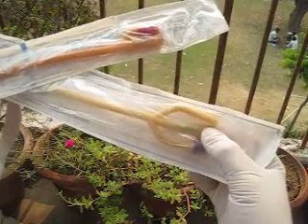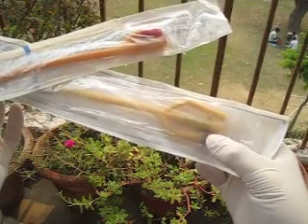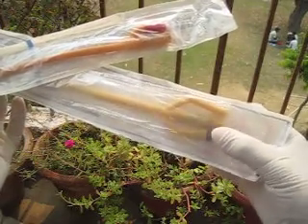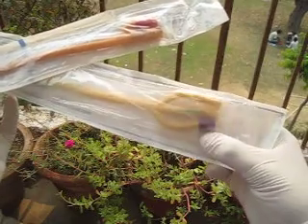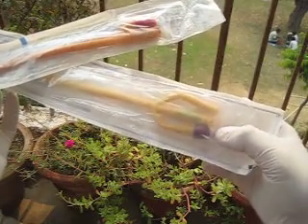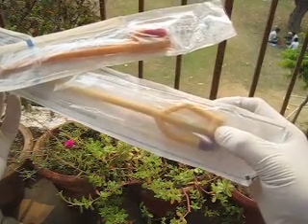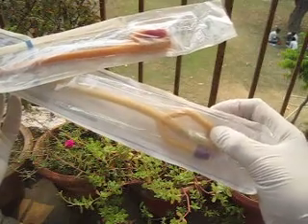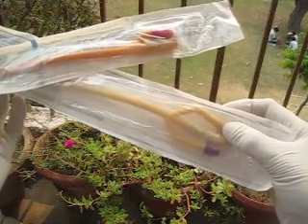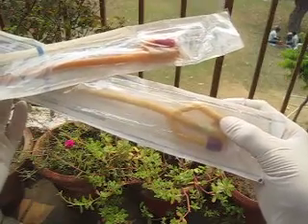This is another catheter which has three ways. You can see the three ports — this purple color ring is where we inflate the balloon, this is where we attach the urine bag, and the third way is used for irrigation, which we use after TURP or TURBT.